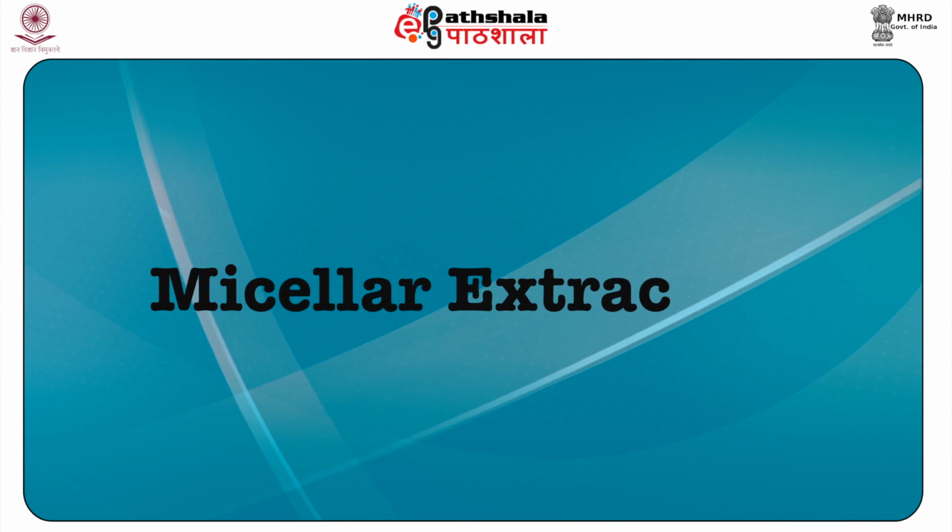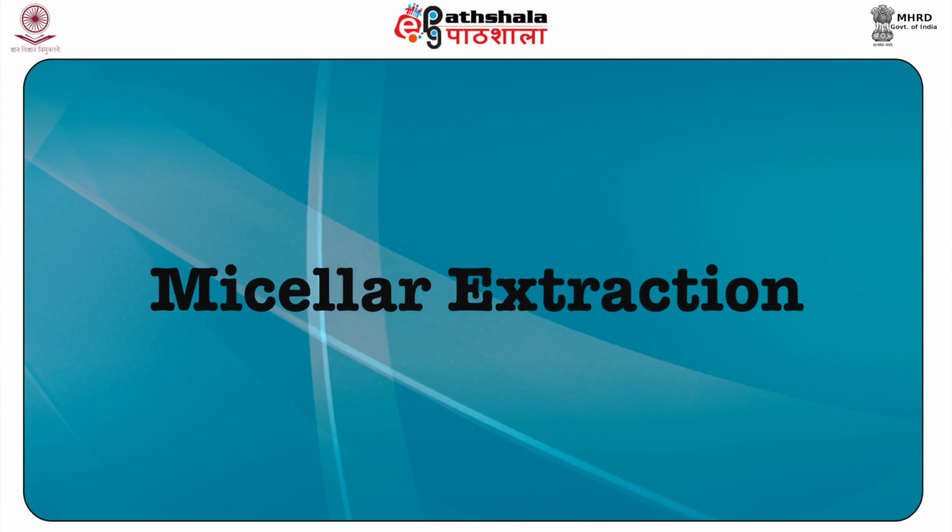Next extraction process is the micellar extraction. Micellar extraction is a special type of extraction procedure or technique that appears to be unique in the separation of drugs, plant poisons and pesticides in biological matrices or viscera.